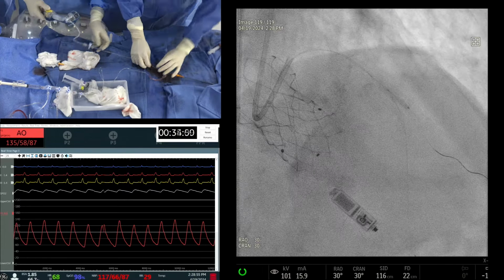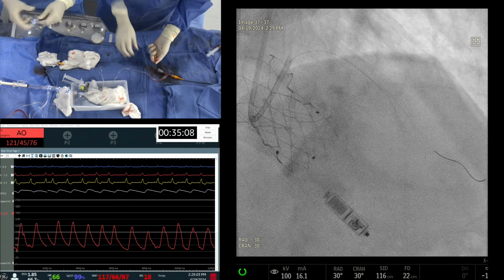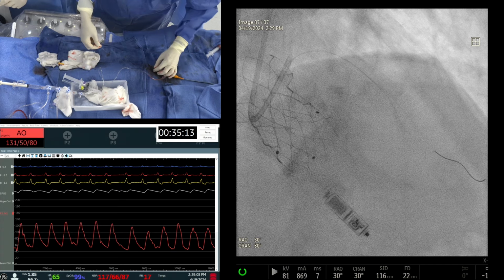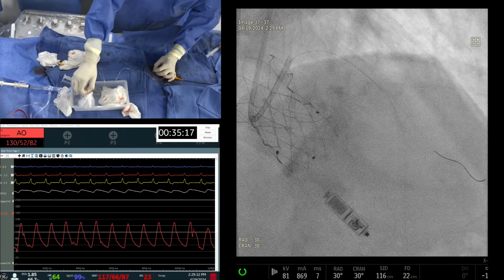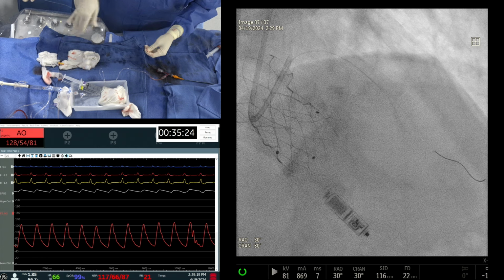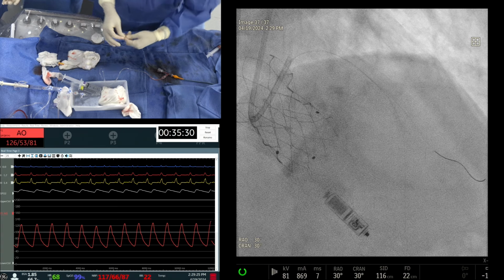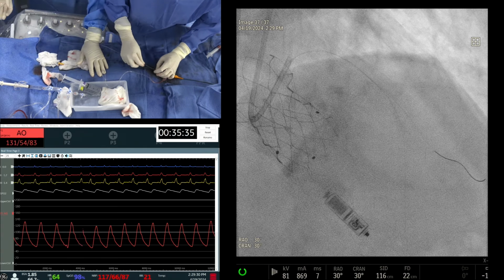Also, we can see what we did to the nodule with the rotational atherectomy. Yep. I think 2.5 into the diagonal shock wave would probably be good. I think if you IVUS it, you probably see that it's a pretty calcified ostium of the diagonal. So even if you get a false sense of balloon expansion, it may not yield, and you may run into trouble. Okay, we are doing it now.